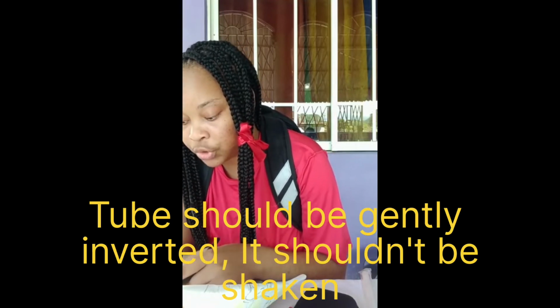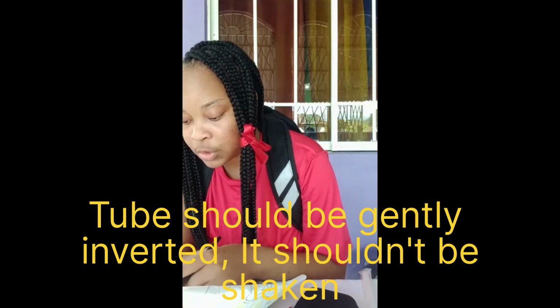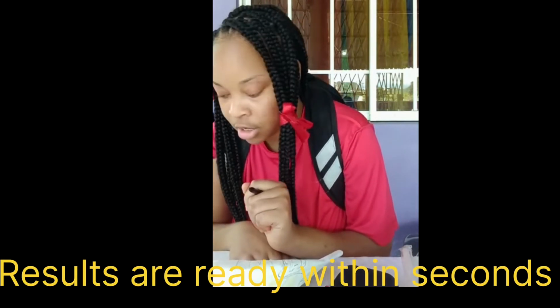Tube filling must be within 90% of the full collection volume with the blood to sodium citrate ratio of 9 to 1. The tube is then gently inverted a few times to mix the sodium citrate solution with the blood. The tube should not be shaken to avoid hemolysis that would lead to inaccurate results. Once the blood sample is ready to be tested, calcium chloride is then added to restore the calcium required for coagulation activation. The interpretation of results now is that the results are normally ready within seconds.